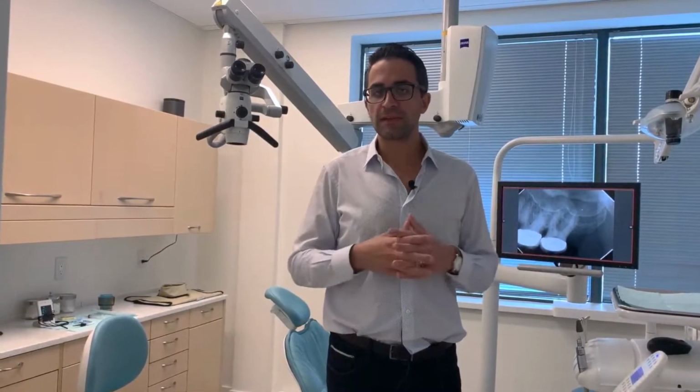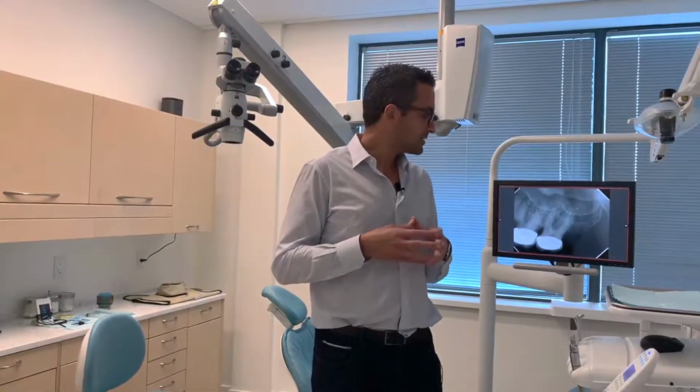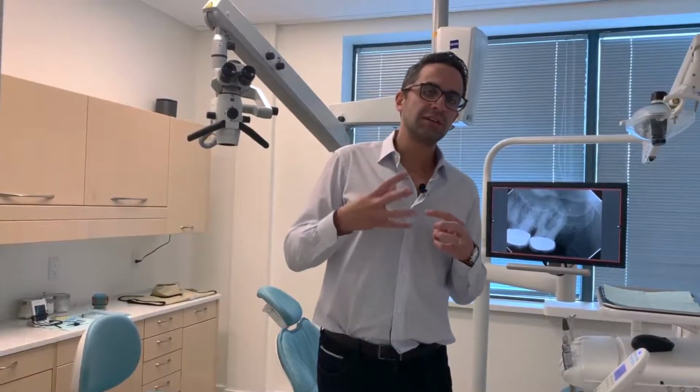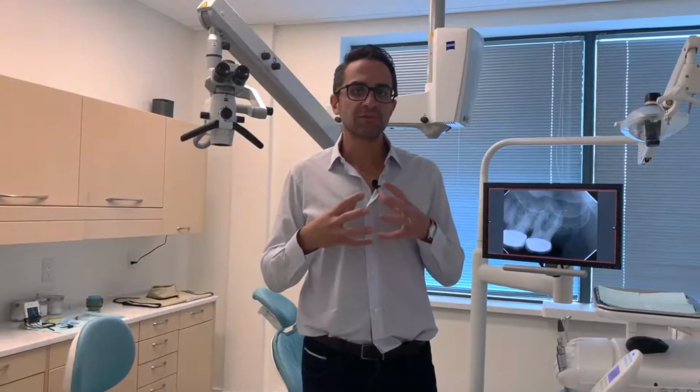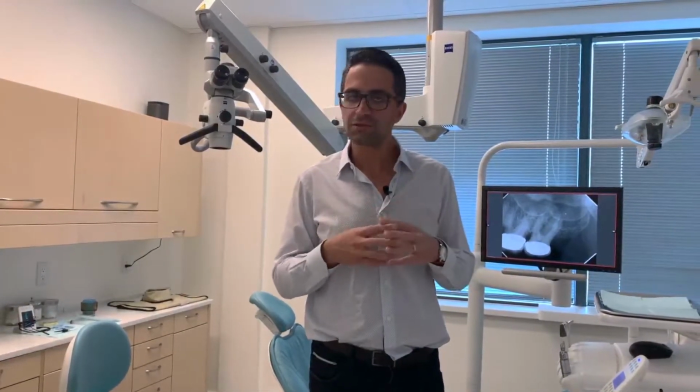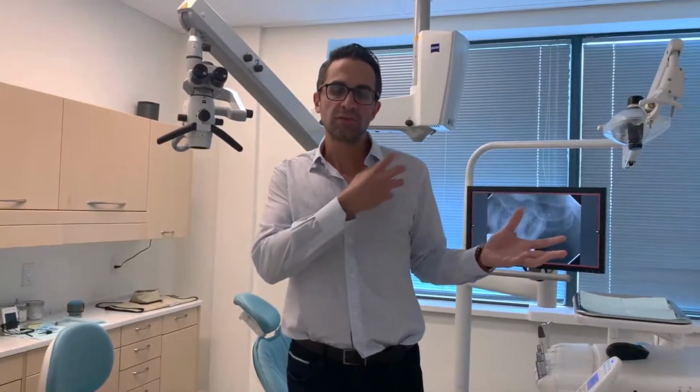So last week I got this gentleman into my clinic who told me, "Doctor, I have this pain in my upper jaw. It's hurting me, it's aching me. I don't know where it's coming from." He was pointing to his left-hand side, but he didn't know really if it's the back tooth or the one before the last tooth.